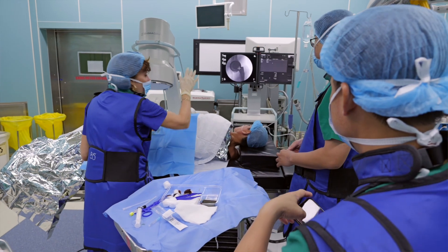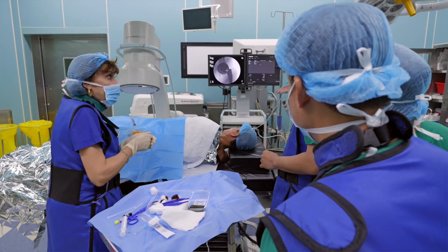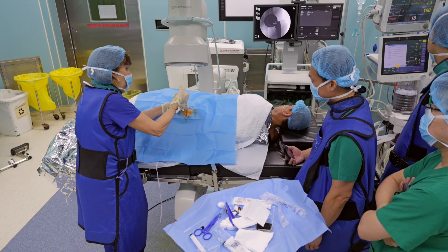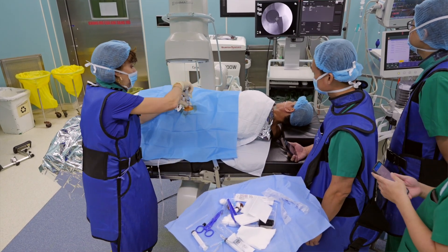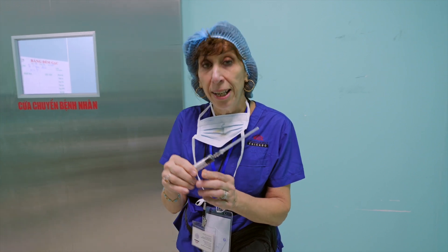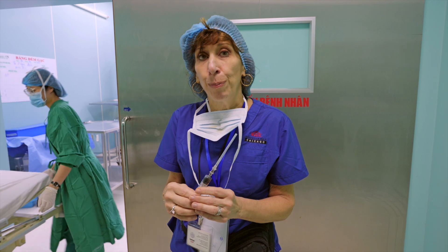We brought him into the operating room and did a hip aspiration under x-ray guidance — that's called fluoroscopy — and drew fluid out of his hip to make sure he didn't have an infection, but also to look for other problems. What we found was fluid that looks like metal debris, so there appears to be a problem where the metal of his implant has deteriorated enough to put debris in the joint. We know this patient will need a revision, and now we're going to be able to plan for it so that over the summer he will be able to have this fixed.